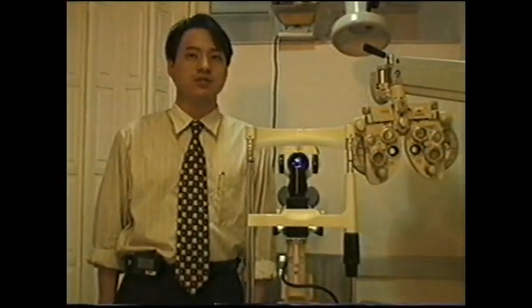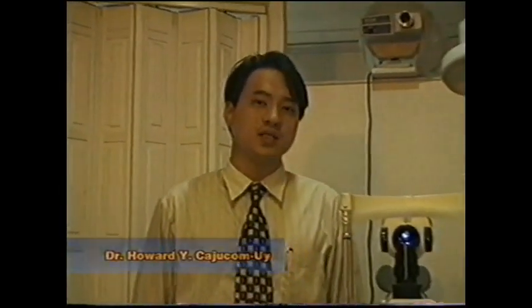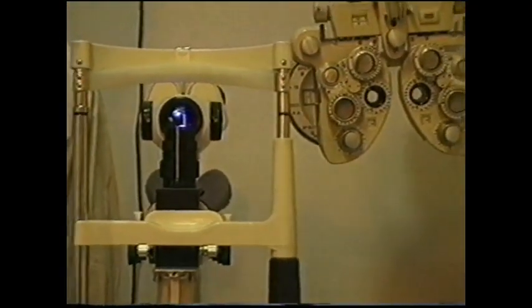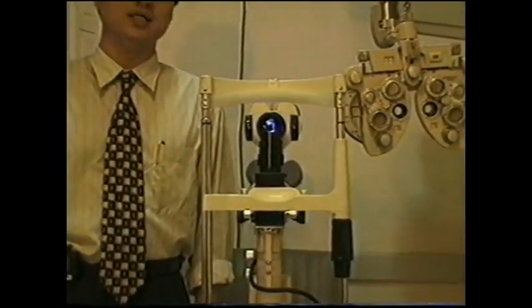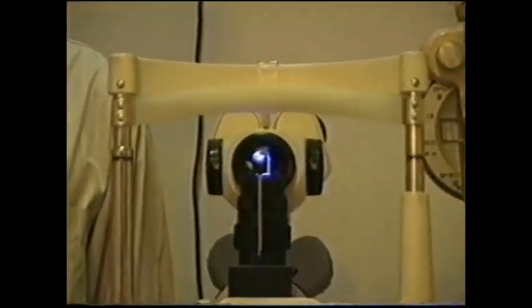Applanation tonometry is one of the more accurate methods of measuring intraocular pressure. Its basic principle is the flattening of the cornea to an area corresponding to 3.06 millimeters, and the attendant flattening is reflected in the dial in the machine, which corresponds to the intraocular pressure. Unlike the other forms of intraocular pressure measurement, applanation tonometry uses fluorescein dye, and the mires in the machine are best visualized under a cobalt blue filter, as will be demonstrated later on.